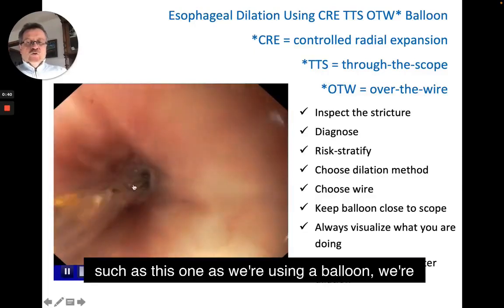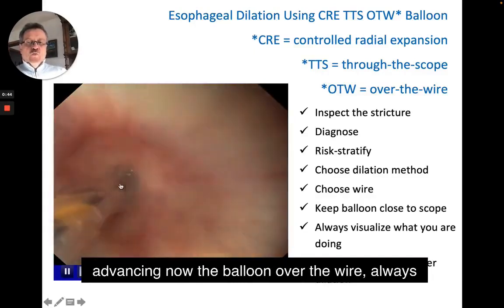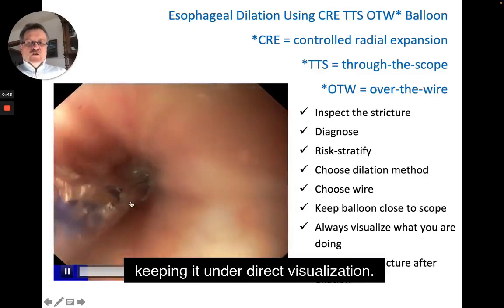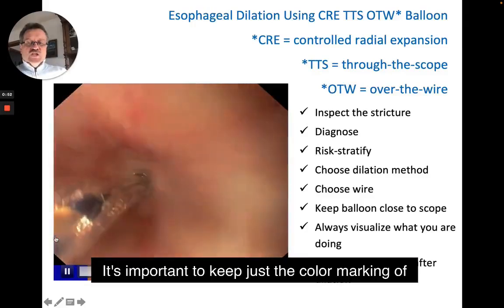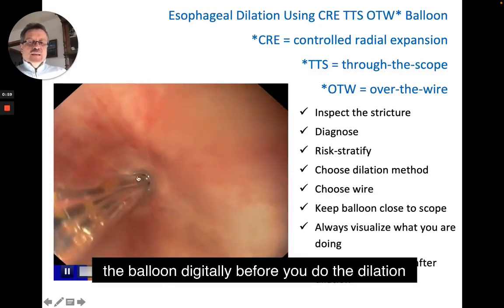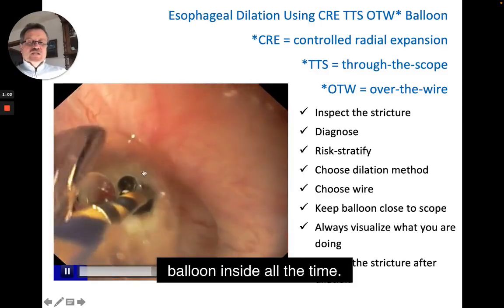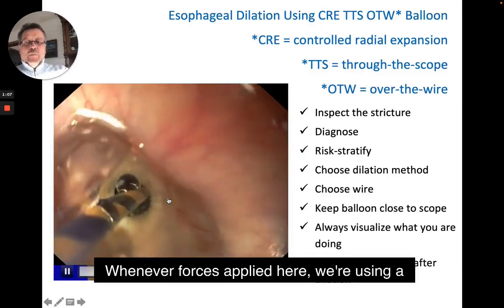As we're using a balloon, we're advancing now the balloon over the wire, always keeping it under direct visualization. It's important to keep just the color marking of the balloon distally before you do the dilation, and importantly keep the balloon inside at all times whenever force is applied.